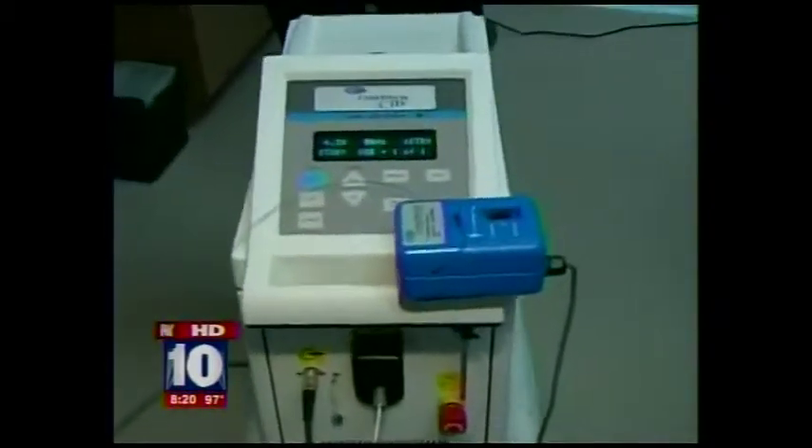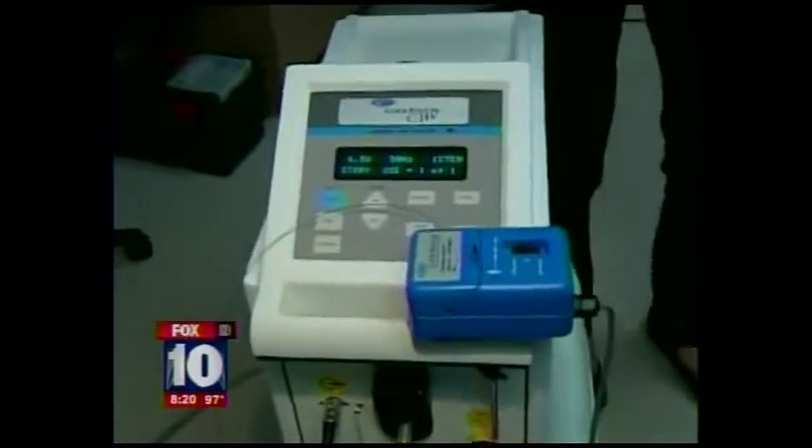We are inside the Morrison Vein Institute right off Belle and Princess, and we are talking about something new here at the Institute. This is a type of laser called the cool touch. With me is Dr. Nick Morrison, and this is what he is doing now to help people with vein problems.